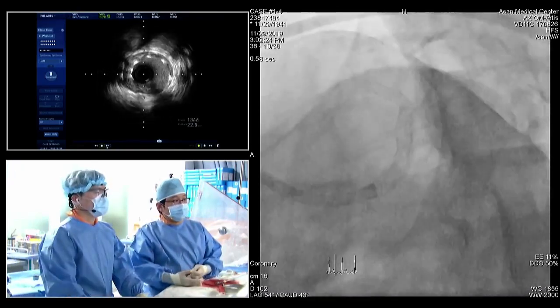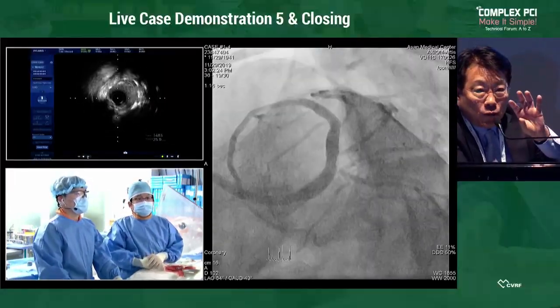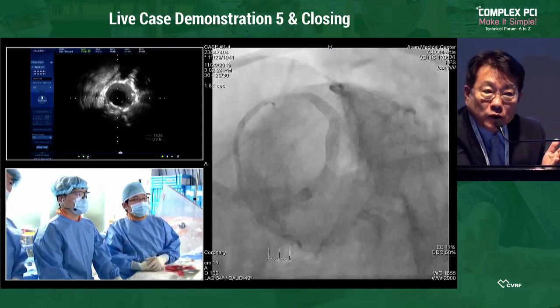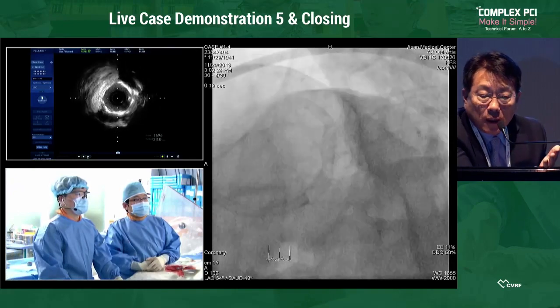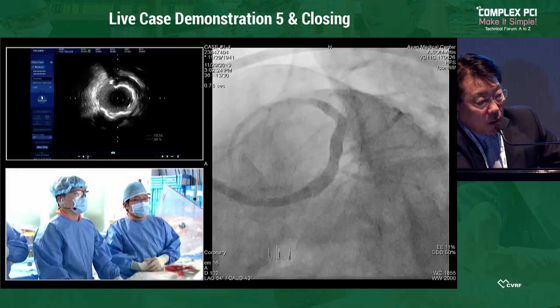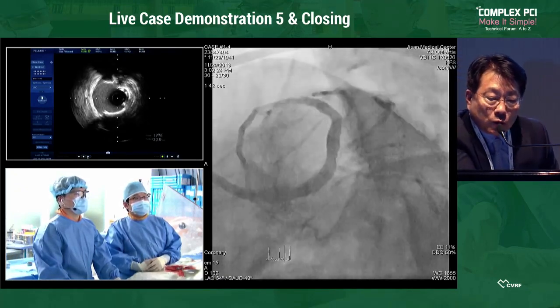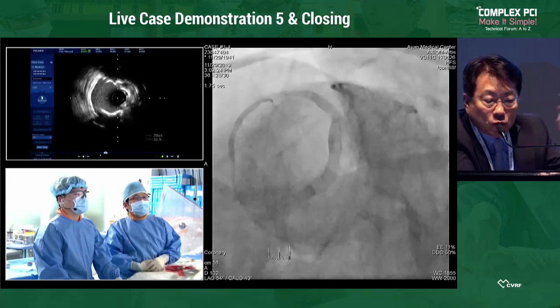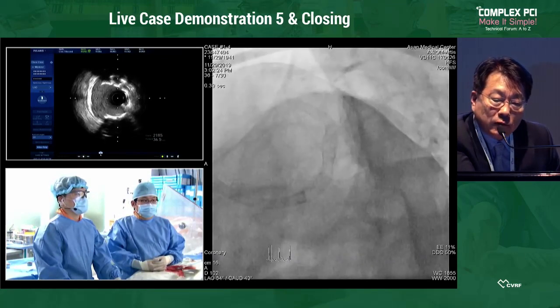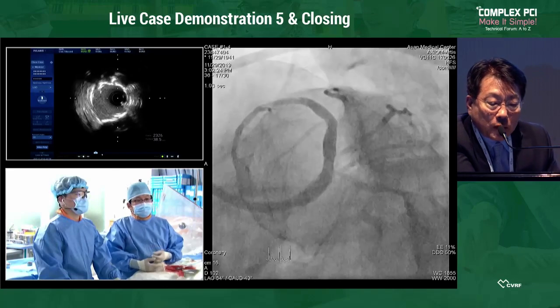Right. Next, please. A clear message from this view: in these cases, even with heavy fluoroscopic calcifications, non-compliant high pressure balloon works in almost all cases. So, Dr. Ang, how could you define in what cases you do rotablation first? As in almost all cases we can solve it with non-compliant high pressure inflations. However, when did you consider rotablation first, what is your criterion?